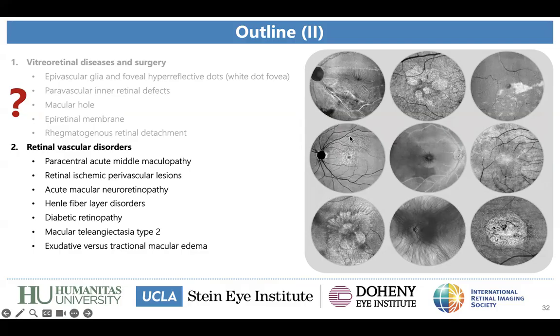I have a point to add to this discussion. I'm really a fan of real-life studies, and we know that every diagnostic method has failures, and we have learned a lot with OCT and angiography about how to handle artifacts.